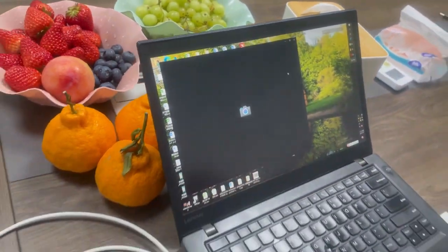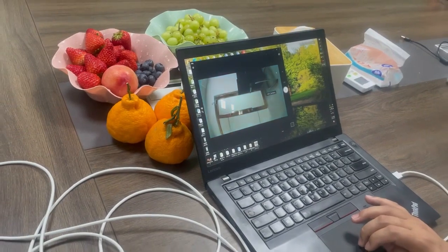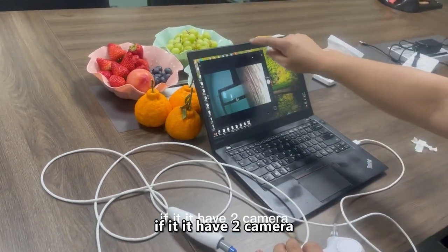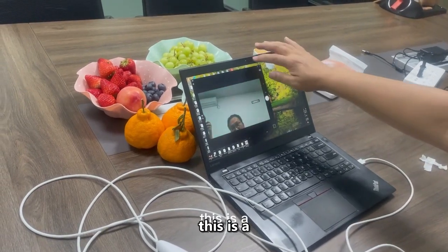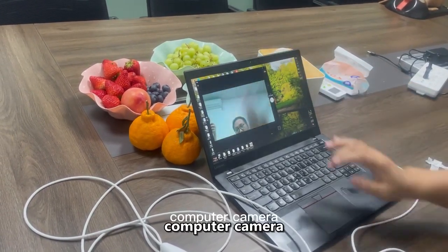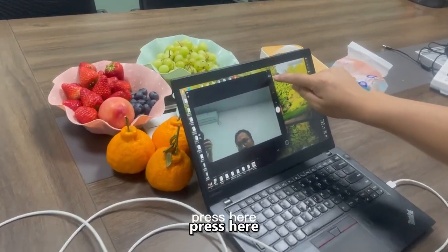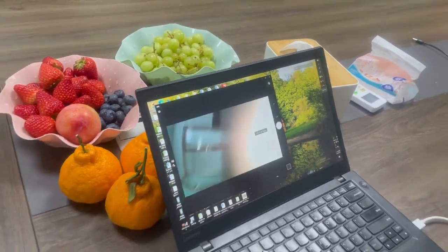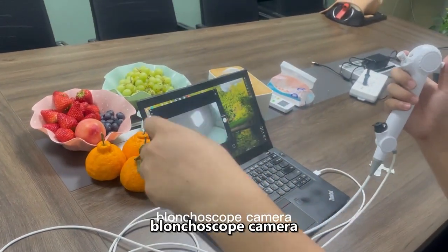Press here. If there are two cameras, I can change it. This is the computer camera — then press here to change it to the bronchoscope camera.